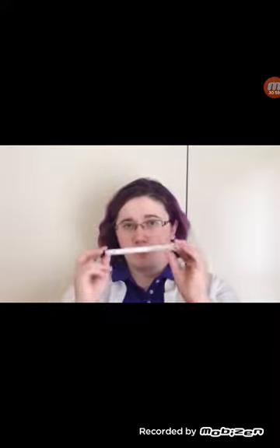Now you do one swab with one cheek, and then you'll do another sterile swab with the other cheek. Same process, 40 seconds, same movements on the other cheek. Then you'll take both swabs, put them in a bag, and hand them to the researchers or send them to the lab so that they can be tested. And that's how you do a buccal cell sample. Thanks for listening.